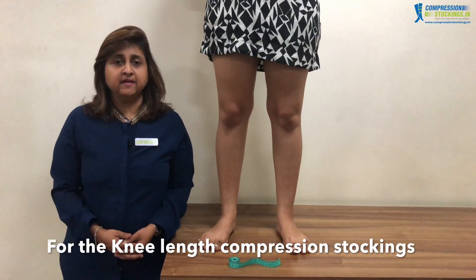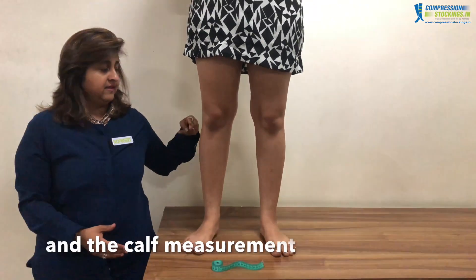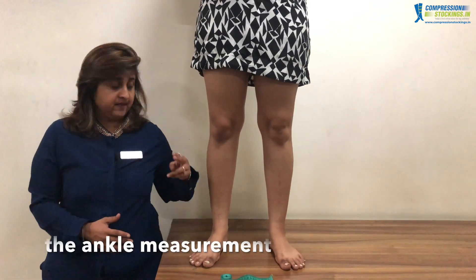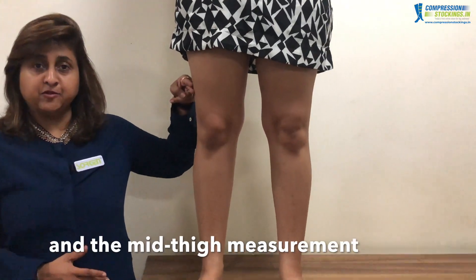For the knee length compression stockings we need to take two measurements: the ankle measurement and the calf measurement. For the thigh length compression stockings we need to take three measurements: the ankle measurement, the calf measurement, and the mid thigh measurement.